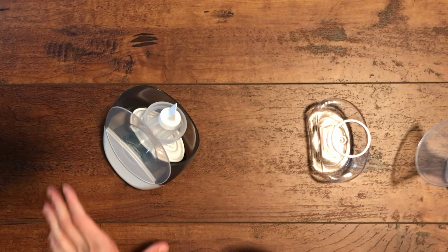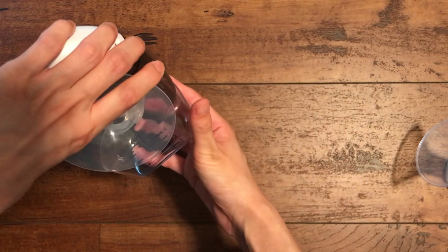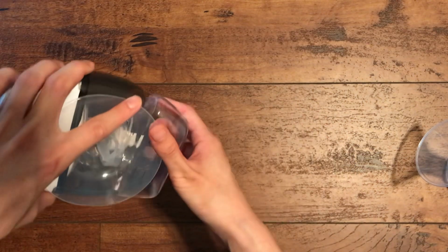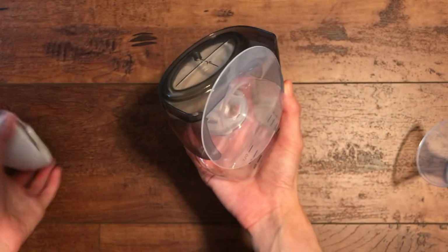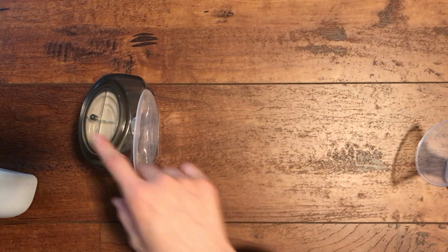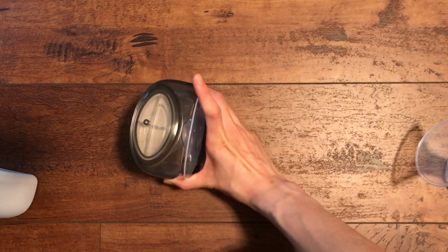So if you have to put it down, if you want to switch the unit, either have another bottle ready to go, or you can take out this pump first, because this is the heavy part, and then put it down like that, so that the milk doesn't get to the protector part so much. So yeah, that's what I would do.